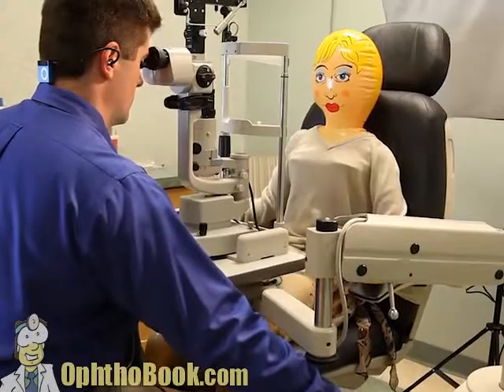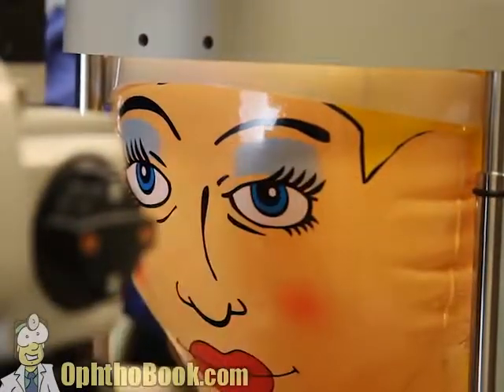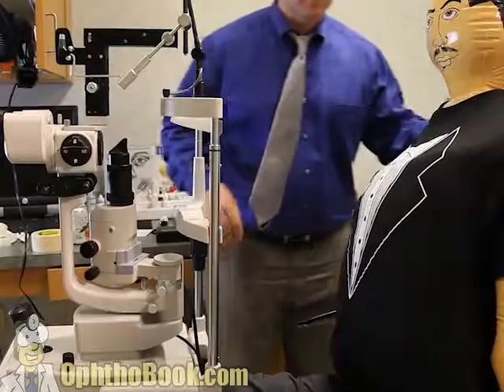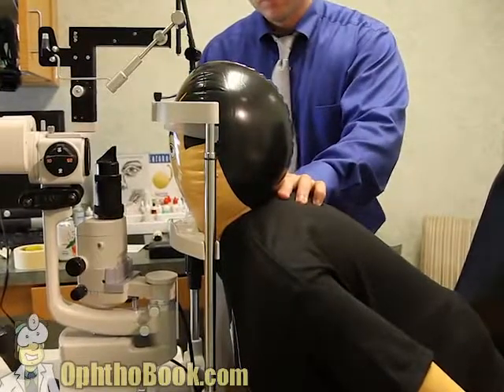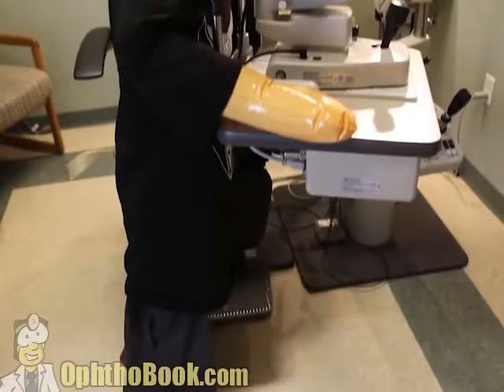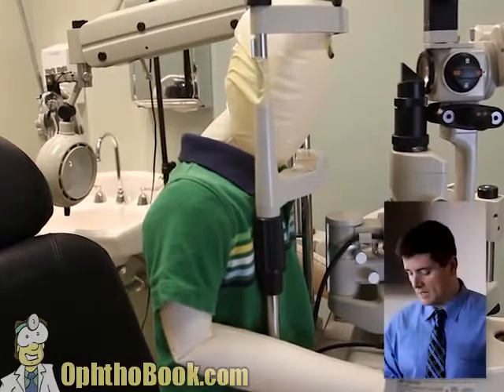Only then do you start worrying about the patient and set them where they're comfortable as well. Our goal is to get the patient's forehead against the bar, chin on the chin rest, and line up the lateral canthus of the eye with the black mark to get maximal excursion. The patient can grab onto the side of the table or microscope. Occasionally with a large patient, I make the microscope very low and far away so they can rotate down into it. With children, they have short torsos, so it's helpful to have them get on their knees to reach the microscope.